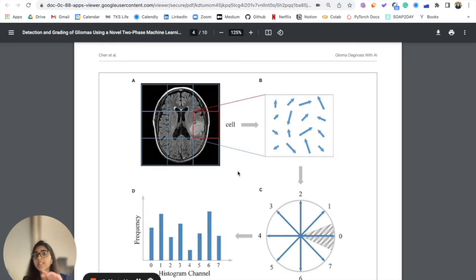Since the MRI scan itself is literally a rectangle, it would be a lot more beneficial if the dense grid of uniform spaced regions, the HOG cells, were all in the form of a rectangle instead of a circular shape. And they also said it was because of better performance, which again makes sense because of preserving the spatial information.